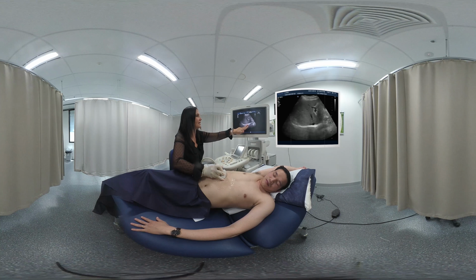So let's have a look at that just for a second, just getting sidetracked. So this gallbladder is actually exhibiting a wall echo shadow. So breathe away, patient. So what we're seeing here is the gallbladder wall filled with stones. So this is filled with calculi. So this is actually the wall echo shadow, or a WES sign. So we'll learn about these in our lectures also.